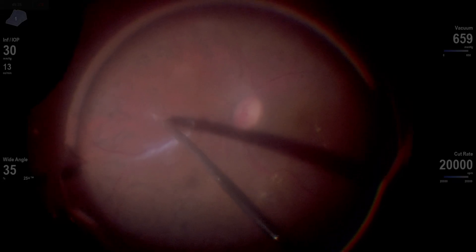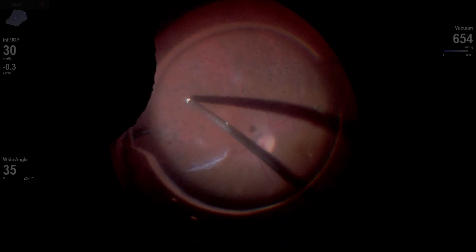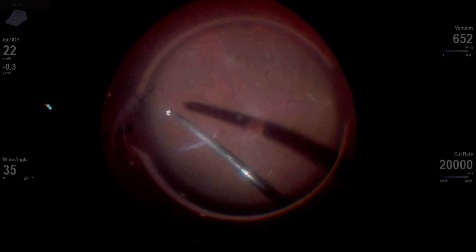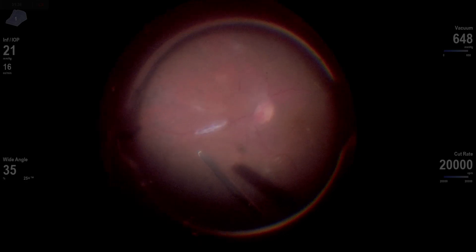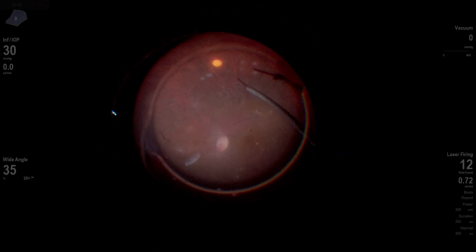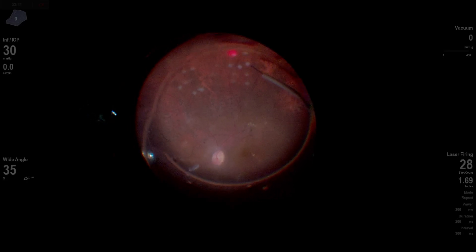As I try and lift, it's going to actually pull there. We've got a space elevated — I'm going to shave along that plaque. Now working more nasally, we get another big blow for freedom as I'm able to lift up a big sheet of vitreous, and that really helps move things along. At this point I've eliminated all traction from this fibrotic plaque along the superior nasal arcade and I'm going to leave the rest of that alone. That inferior vitreous also came up when I got that big elevation of the hyaloid about 30 seconds ago.